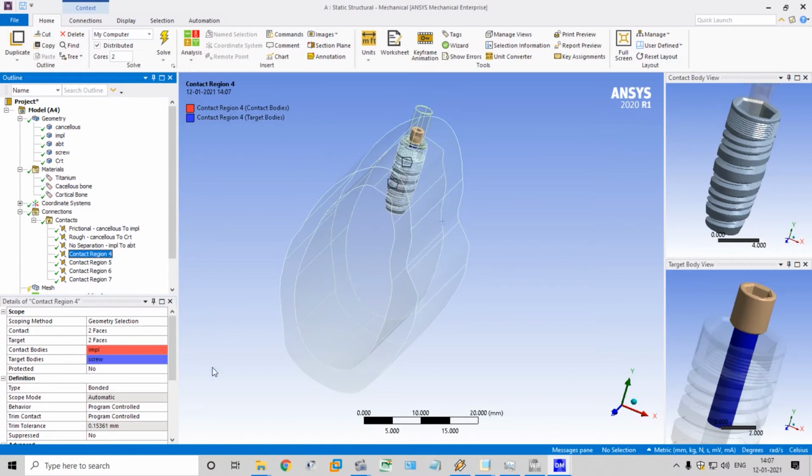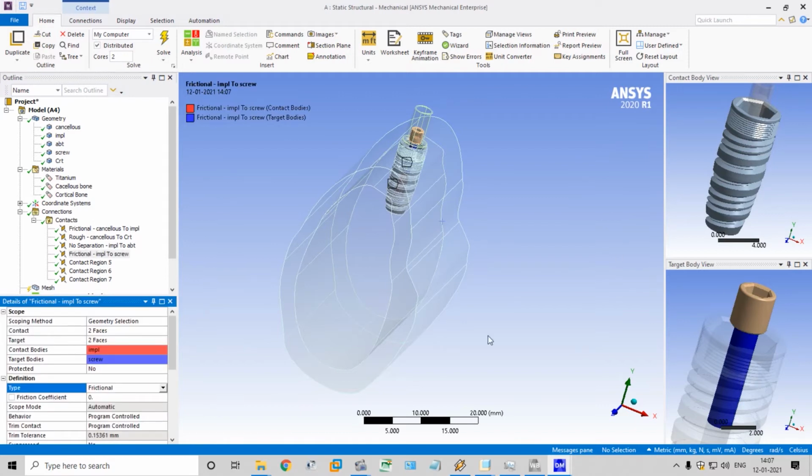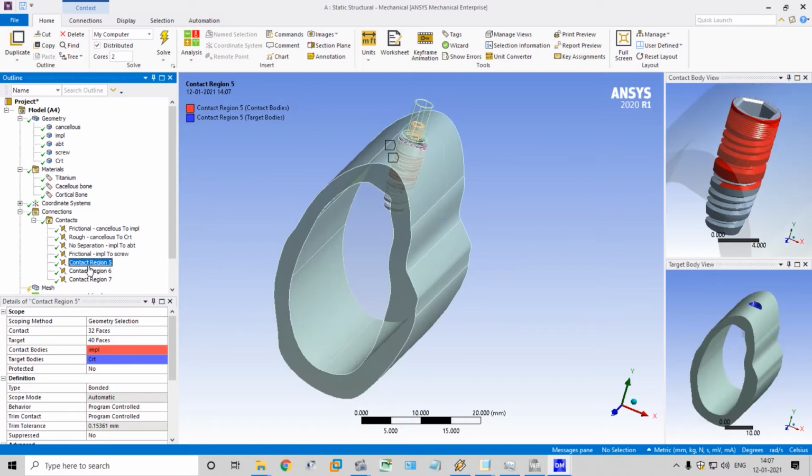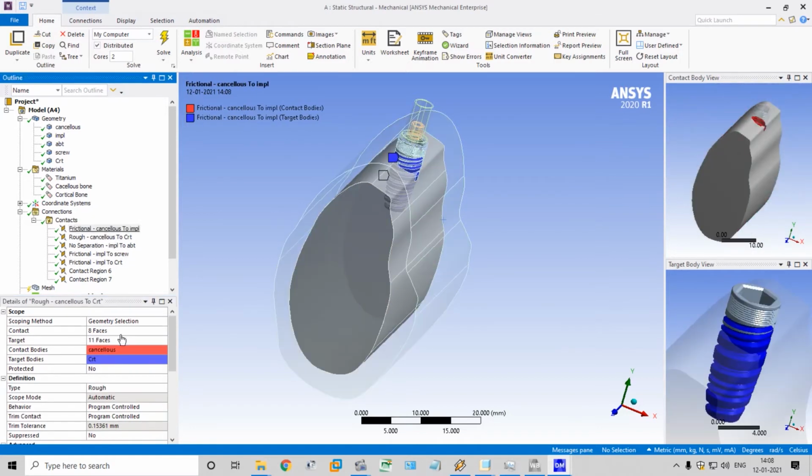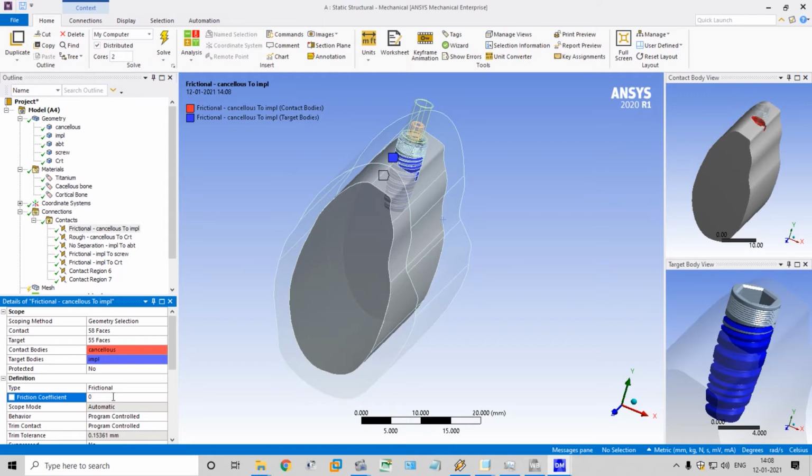Okay, then implant and the screw will be without thread. When we apply the frictional contact, it will act as a thread. While giving results, it will show as a presence of threads. Okay, next is the implant and cortical bone. Contact will be friction. Here frictional contact give 0.2.